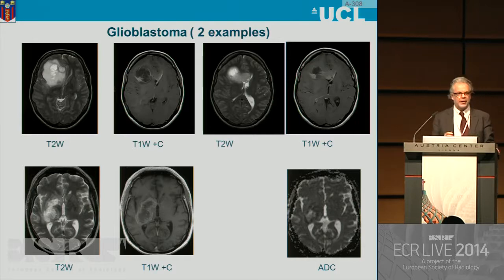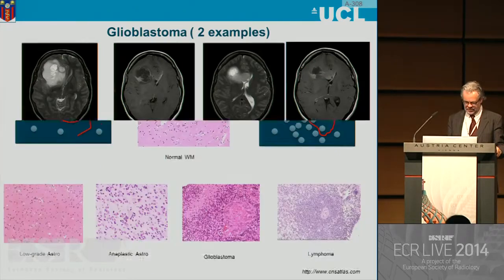So you can use that to differentiate. One word of warning is very important. There are glioblastomas which are not enhancing. You can look at the different figures. It varies from whom you read, from 10% to a third, but that it's non-enhancing does not necessarily exclude a GBM. So in the end, you almost certainly always need a biopsy.